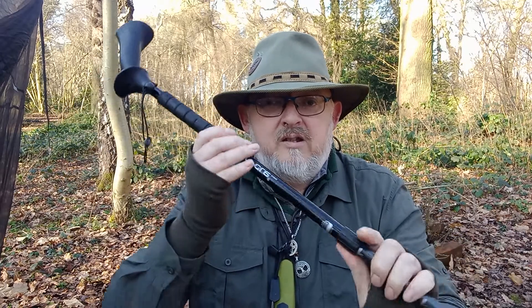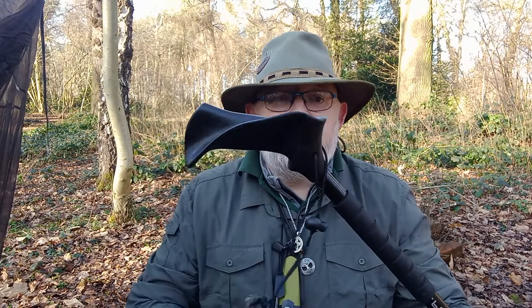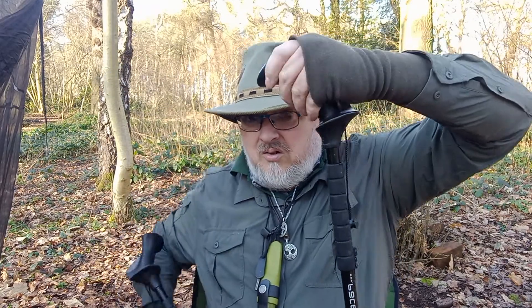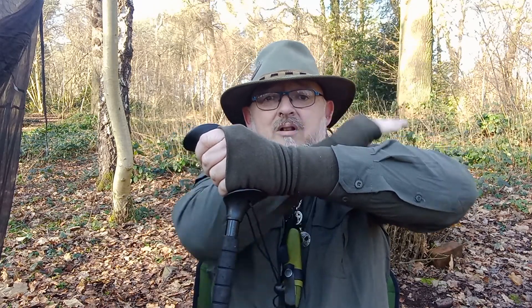What's special about these is the handles. There's a left and a right sided handle. When you put them on your hand, your forearm is going to be straight and then your arm goes up, which in turn straightens your back and your posture. For me, having spinal damage, I need all the help I can get, so I've had these for nine years now.